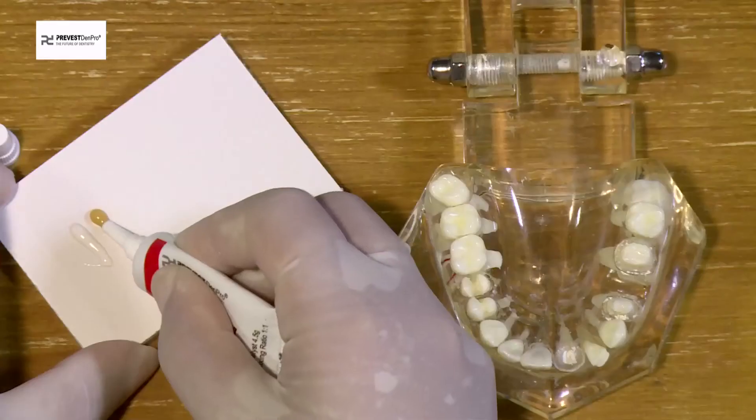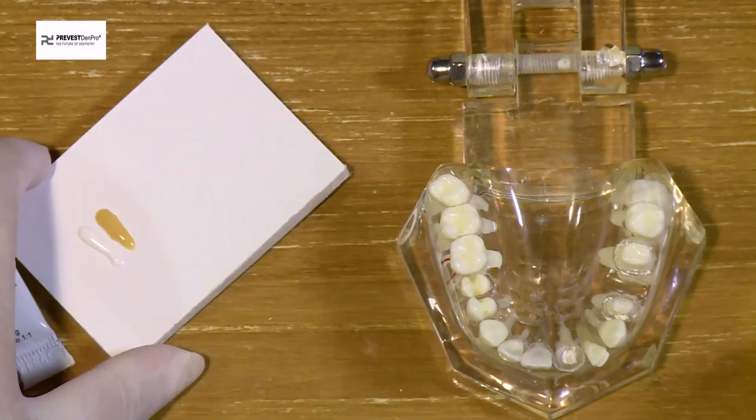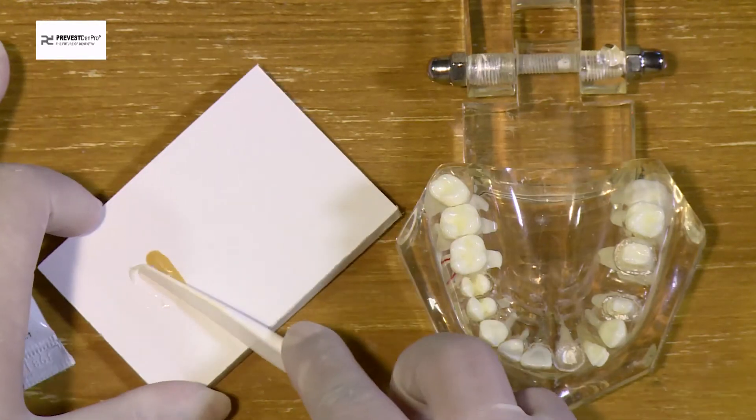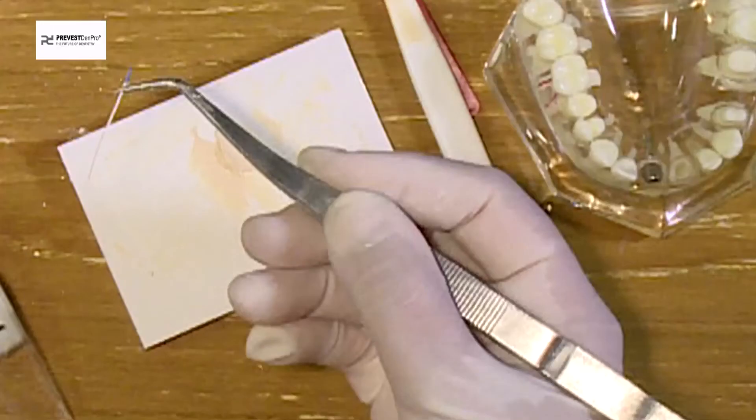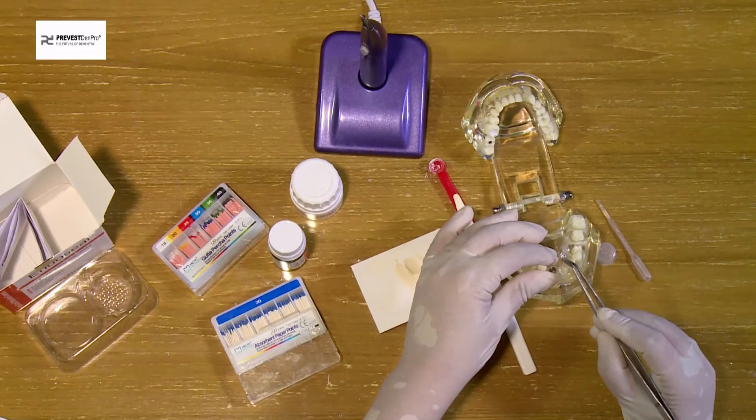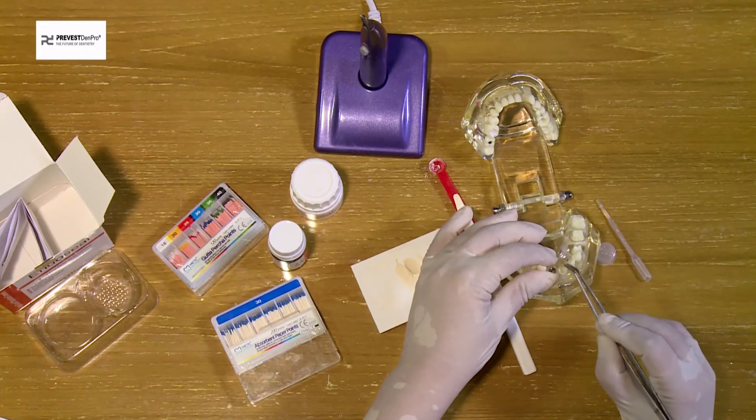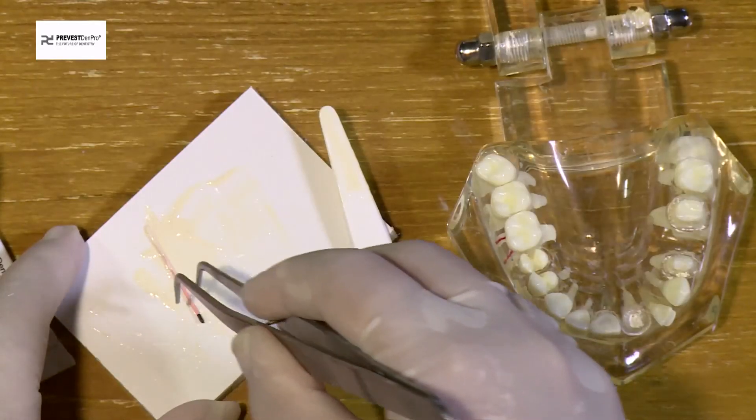The base and the catalyst are dispensed in a one-to-one proportion on the mixing pad. The pastes are mixed thoroughly to a creamy mix. The prepared root canal is then dried using a paper point.